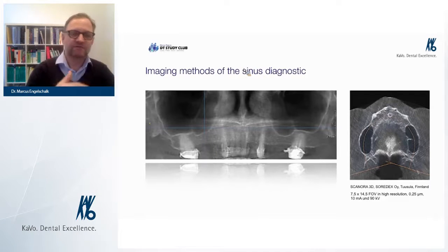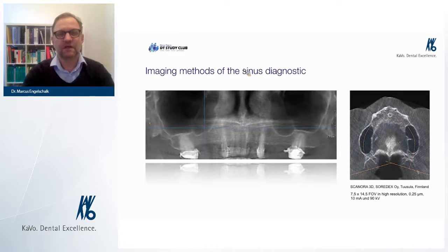And if you want to lift, doesn't matter if you do the external or internal sinus lift, you have to be very precise to remove the membrane from the bone there. Sometimes it's difficult to see. And I think the most important thing for the anatomy is that we have a mucosal thickness of around 1 millimeter. This is very, very thin.